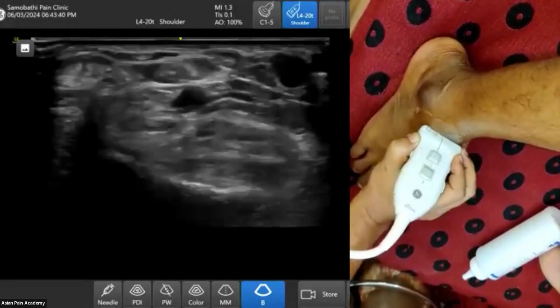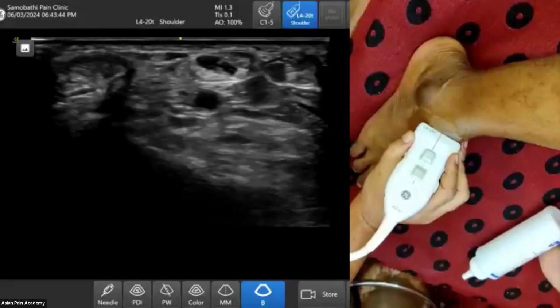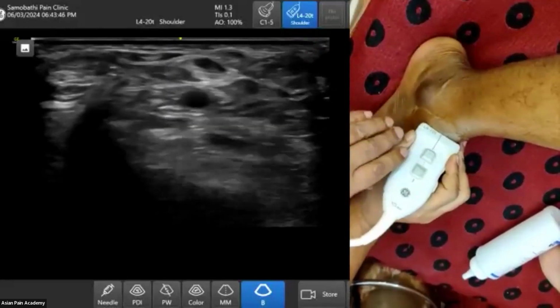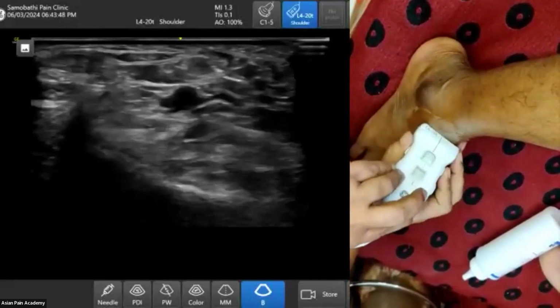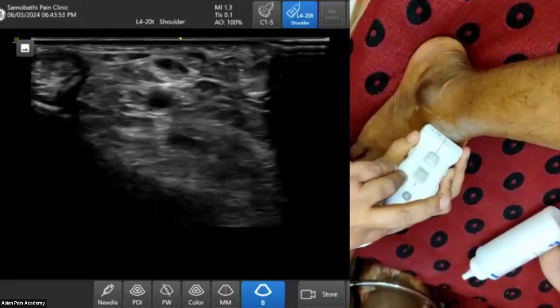Okay, I am just making you wait. I will freeze it, otherwise it becomes difficult.